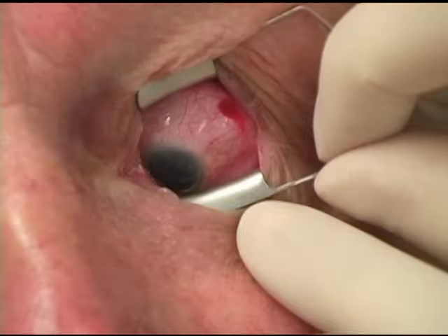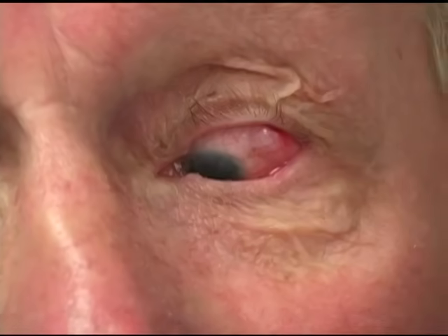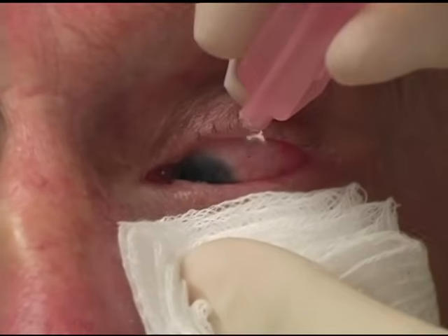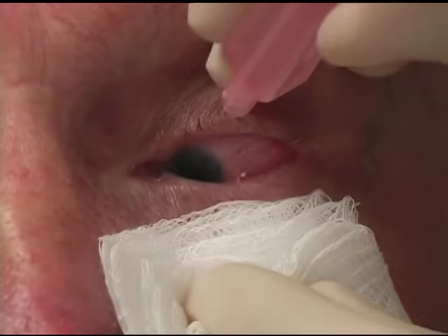The lid speculum is then gently removed and the eye is irrigated to remove any excess povidone iodine, which is an irritant. An antibiotic drop is placed. The vision is briefly checked to make sure there is at least light perception after the injection. The patient is then instructed to go home and continue the antibiotic drops for three days.